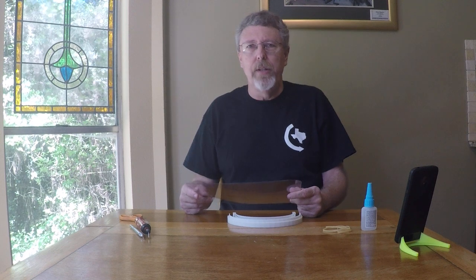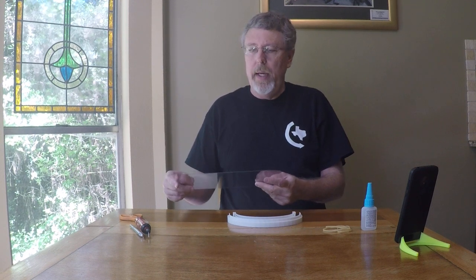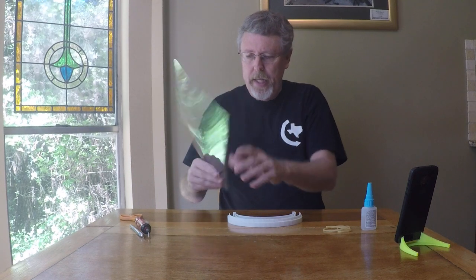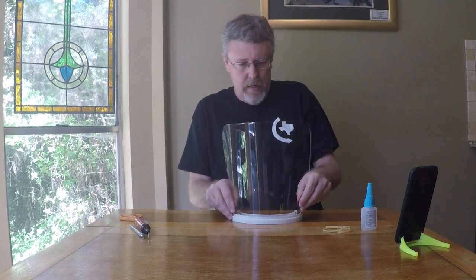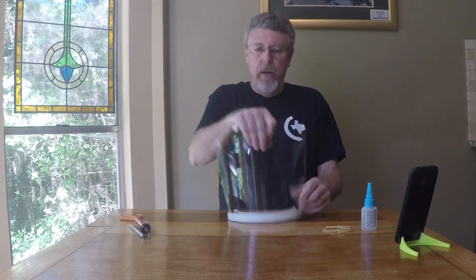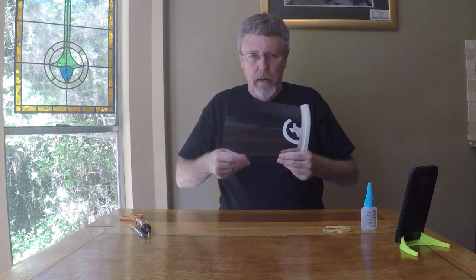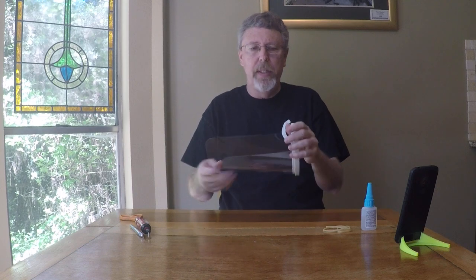This is the face shield we call 1477 Rev 6-2. I've already processed this shield here, so normally the next step would be I slide it in, kind of push down on it. And if it goes in well and seems to be staying, then that's how it would get sent to you.